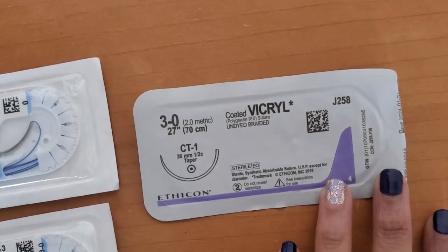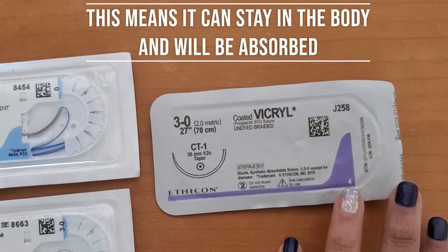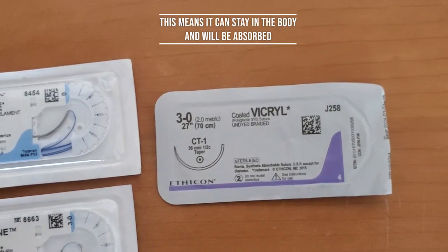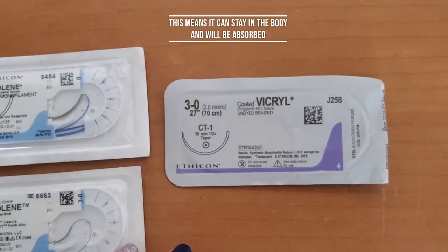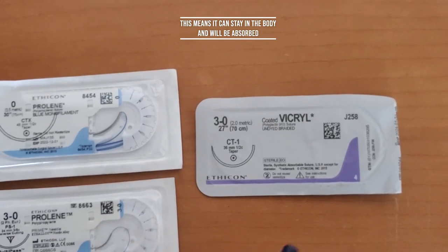Now this suture is Vicryl, so this is an absorbable suture. We put this in our more inner layers, like the dermis, if it's a really big laceration but we want to make sure that it pulls together really neatly. We'll use Vicryl if we want to make sure that it pulls together extremely neatly. So you'll put the Vicryl down into your laceration, into the most inner part, and pull that together. We usually just do some simple interrupted sutures.